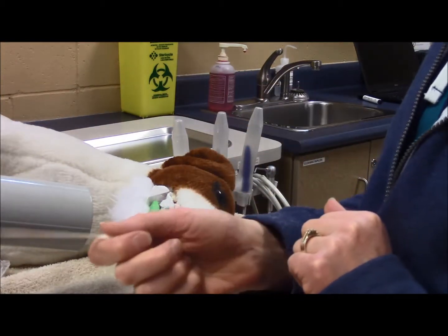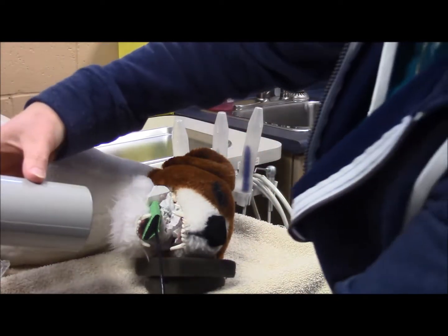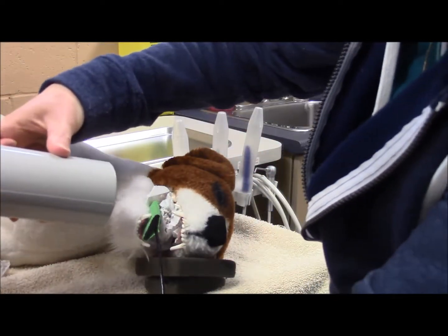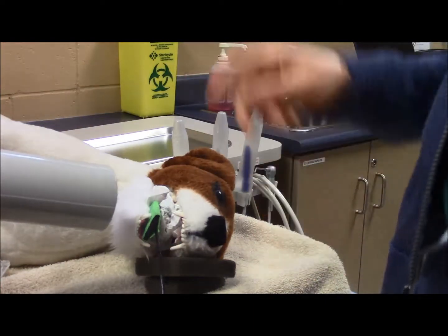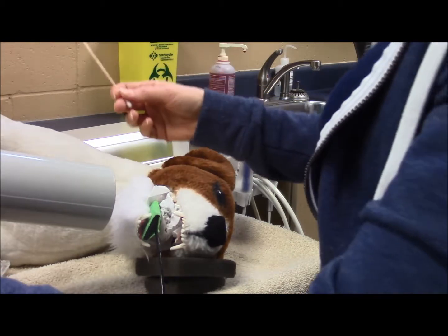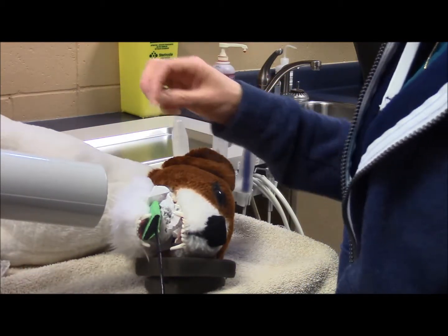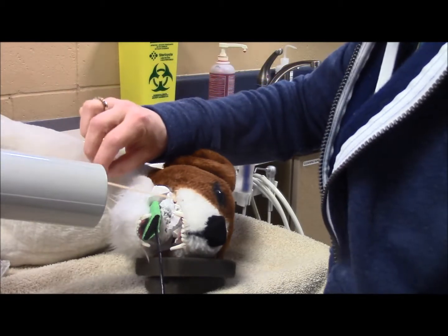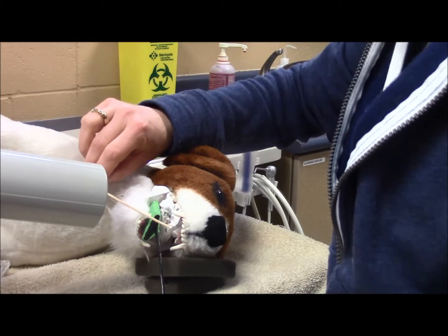The cone should be at a 15-degree tilt to image mandibular canine teeth, and you want to make sure that you're centered on the canine tooth that you easily can visualize from the front as well as looking from the side. To find the bisecting angle for your canine tooth, it's a tooth at the front, so you're going to stand at the side. Remembering that the tooth, instead of following the crown, it does curve quite distally.